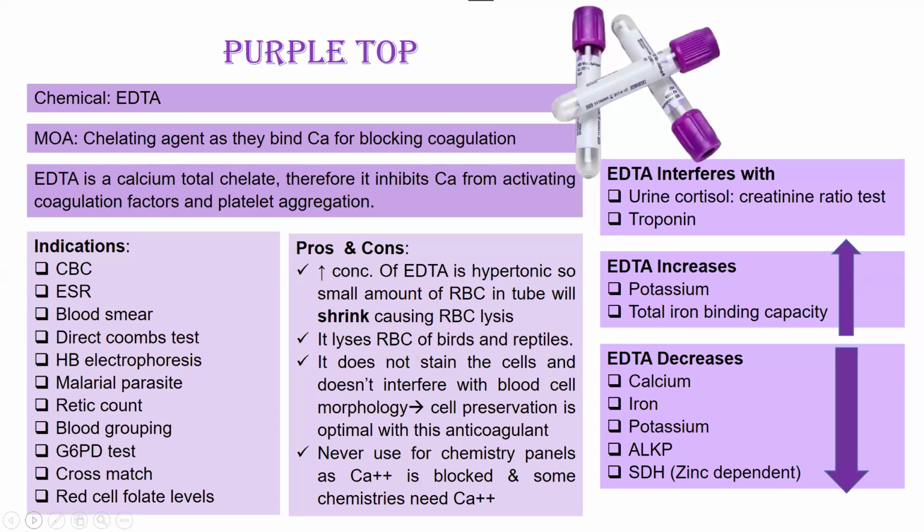Basically, this video is going to be easier for you if you already have knowledge of blood hemostasis, or you have seen the video that I previously recorded and uploaded on blood hemostasis, because these tubes are interacting with the blood, and the blood has the ability to clot through a proper series of processes, and calcium, thrombin, fibrinogen, all these are involved in it.